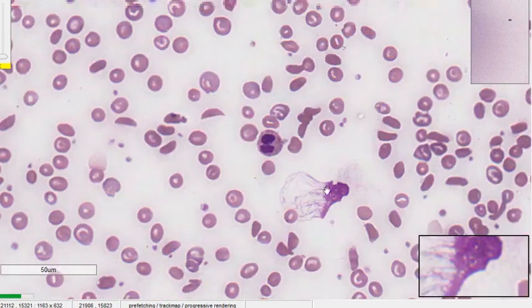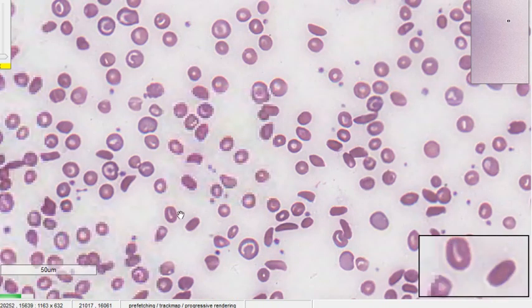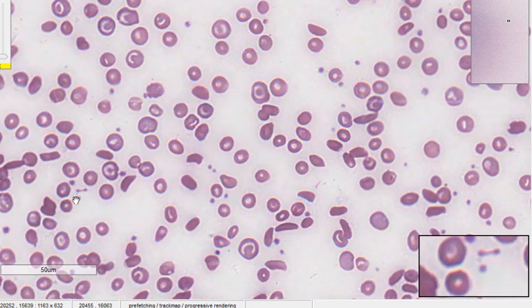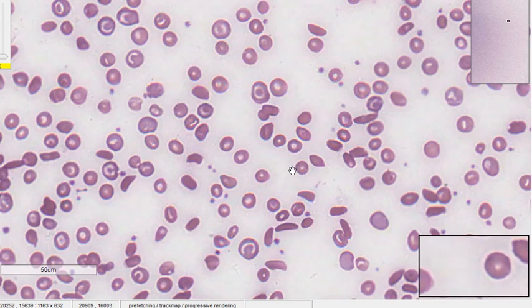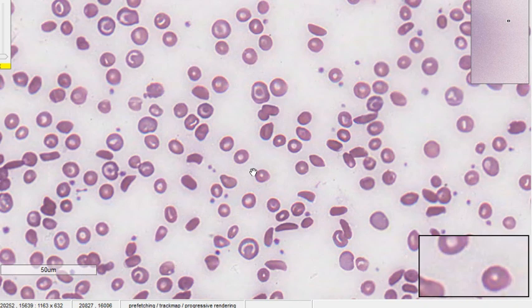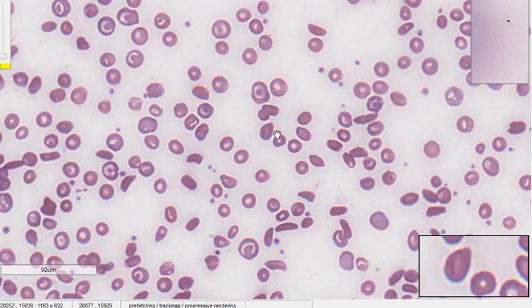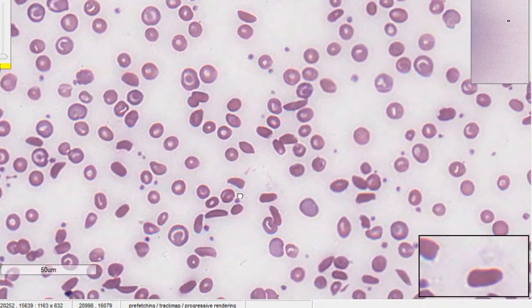Now looking at the platelet series: there are many platelets visible — one, two, three, four. We need about eight to twenty-four platelets per oil field; if that count is present, the patient has an adequate amount of platelets. This patient appears to have adequate platelets.